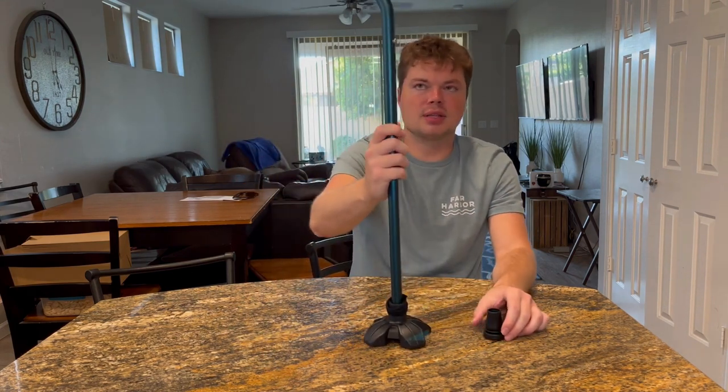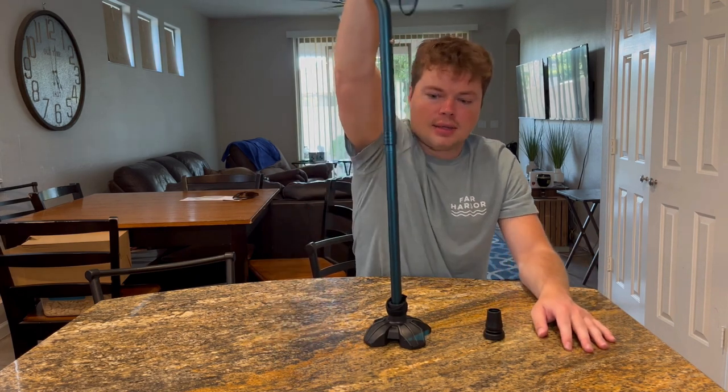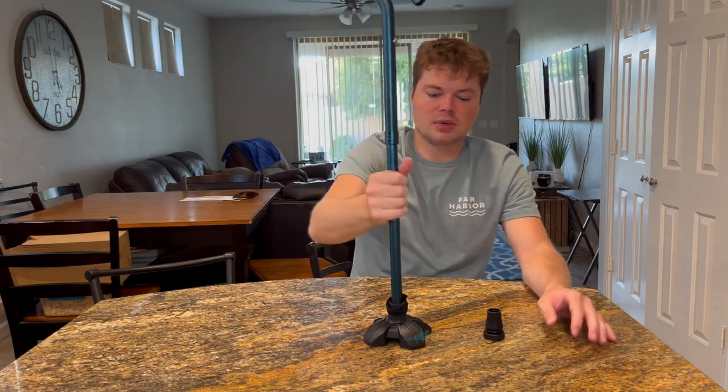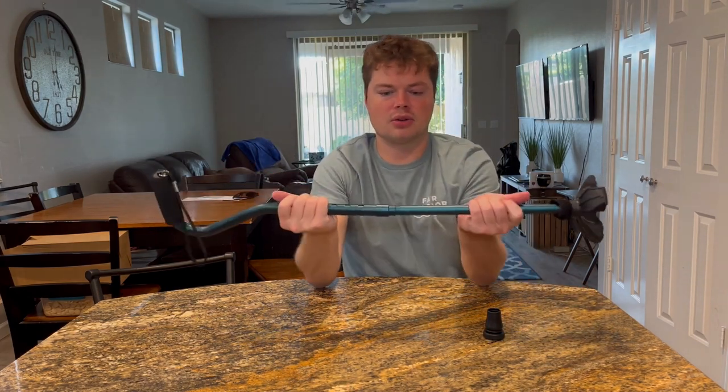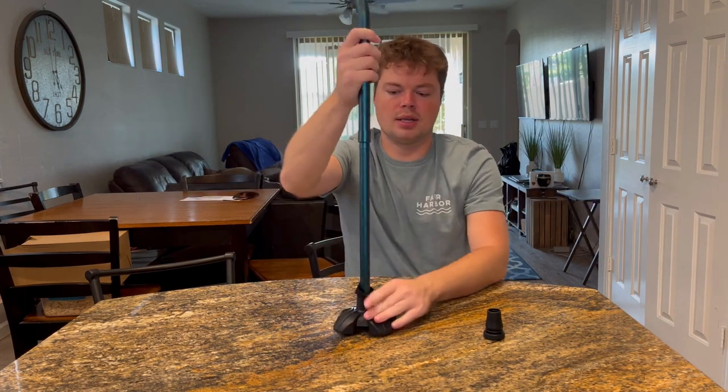Hopefully that answers any questions you have. For the price, it's awesome bang for your buck. Pretty sturdy. And what's great about it is you can throw it in your purse — you literally just fold it like that. It has a little strap so you can keep it strapped together. When you need to use it, take it out, put it in, and you're ready to go. Awesome portable cane and great purchase — the person I got it for loves it.